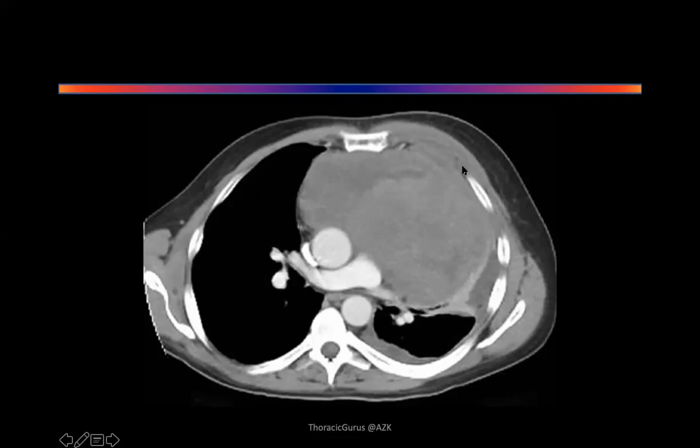What about this? What's happening here? It is invading the chest wall muscle. Excellent. What's happening here? I don't know. In this view, I cannot see the pulmonary artery on the left side. Whether this is the pulmonary artery actually. And what is happening here? Abutting the pulmonary artery. Abutting and what else? What is invading? What is this called? Loss of fat plane. There's a loss of fat plane here. You agree? Yes, sir. Everybody agrees or no? There's a loss of fat plane. See, this fat plane is seen here pretty nicely. Out here, there may be some loss of fat plane, I think. But here, definitely, there is evidence of fat plane.